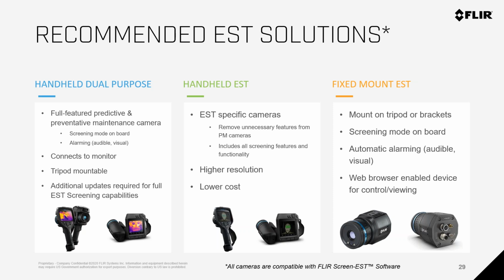One, if you're doing it manually, and let's say the first person that comes through seems higher, and they set it off at 100 degrees, you can say, okay, I don't want to take that sample, I don't want to store that one in my reading. So you can throw that one out, for lack of a better term. You can say, hey, you're already at 100. I don't have a baseline set yet today, but based on our baseline yesterday of 98 degrees, 100 seems really high. Right away, maybe you just pull that person out and have them do the additional screening. So on the manual cameras, you can accept or not accept the different temperatures.